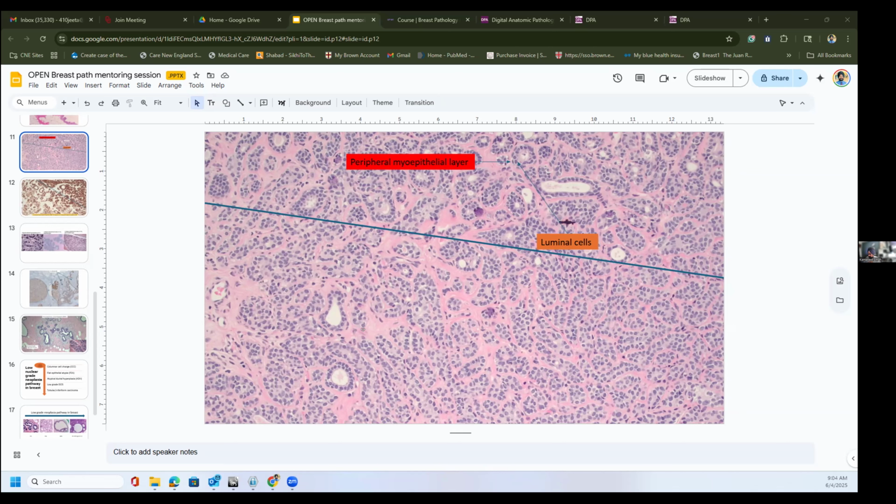And then I know how lobular neoplasia looks like. So what I just described: monomorphic nuclei, pale chromatin, pink cytoplasm, and if there's evidence of discohesion. So these cells are lacking E-cadherin. When they don't have E-cadherin, they don't attach to each other, and you see the spaces between the cells, like right here. So there's a little space.